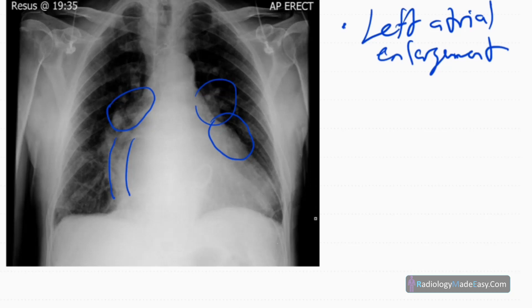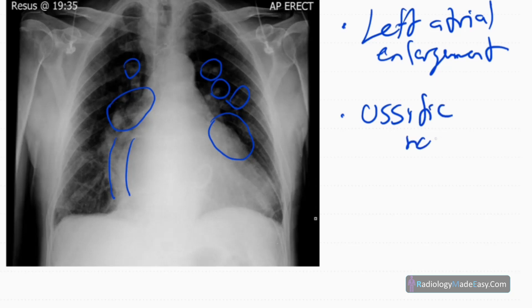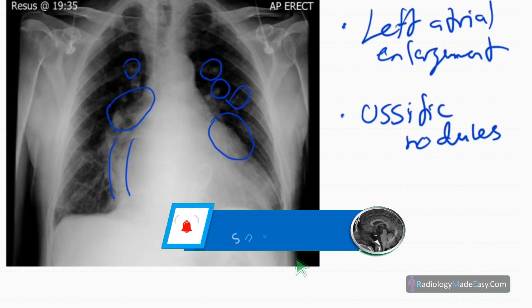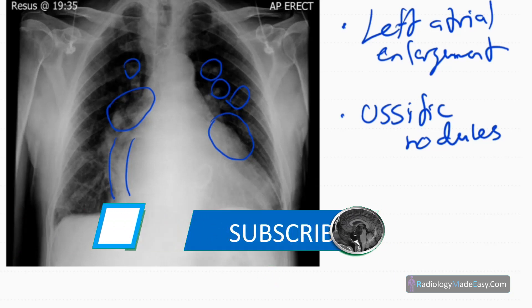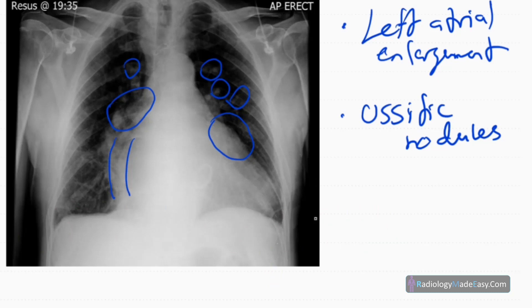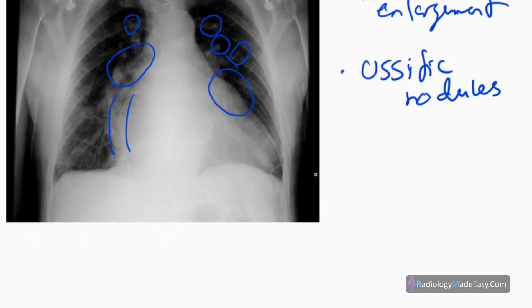There are also some nodules in the lungs — high-density rounded opacities. These are pulmonary ossific nodules. These occur due to increased pulmonary venous pressure: there is bleeding into the alveoli, causing pulmonary haemosiderosis. In the chronic stage, those hemorrhages calcify and form pulmonary ossific nodules.